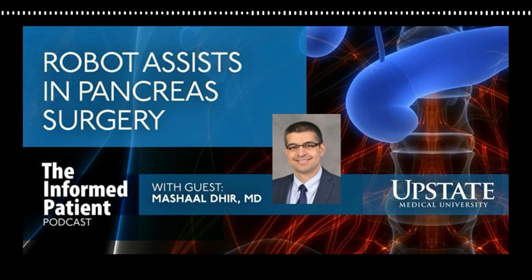So, for the traditional open surgery, the open Whipple procedure, how long does that typically take? For that traditional open, it can take from 6 to 8 hours in general, but can vary based on certain factors, how difficult it is to remove the tumor, if you have to do additional work on the blood vessels, and other factors. And are there risks during the surgery and after the surgery?